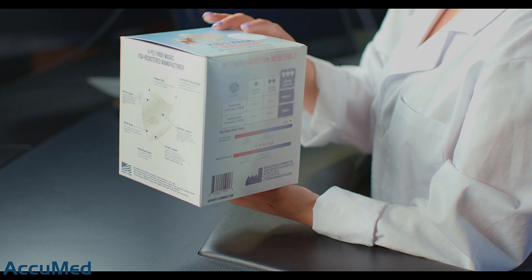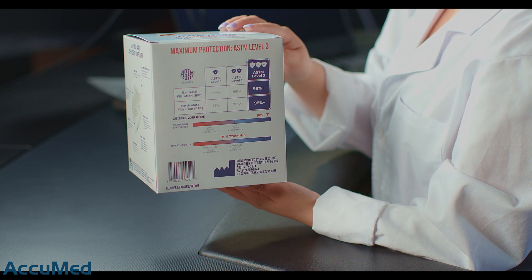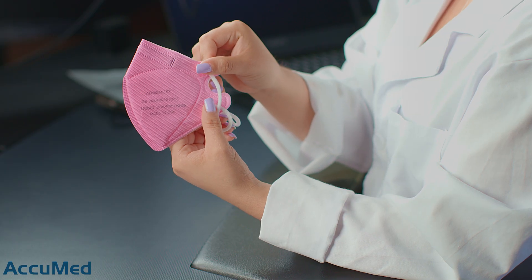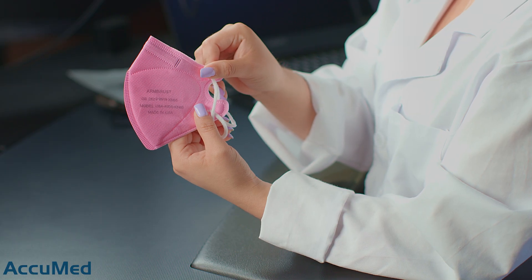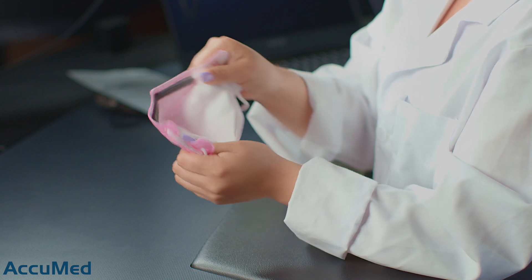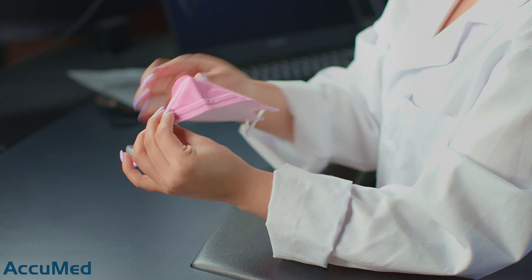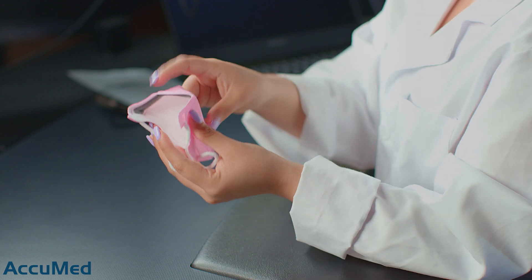The packaging is also very similar to the Adults K95. They claim to be ASTM level 3 and it shows their filtration efficiency and breathability results. Looking at the mask, it has very nice construction quality, with a nose wire and nose foam.